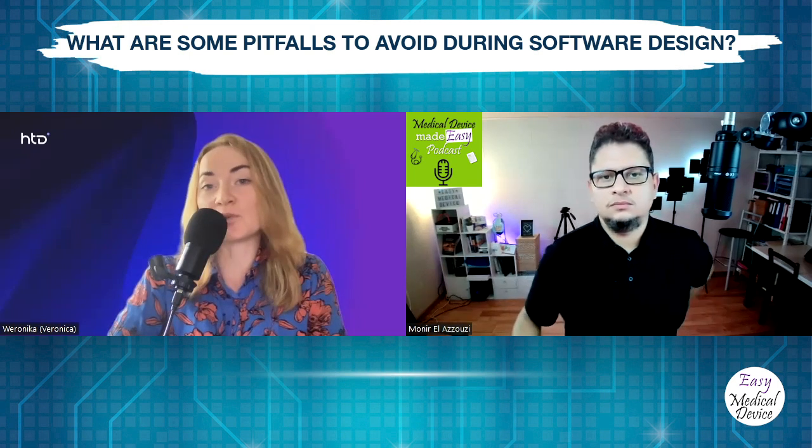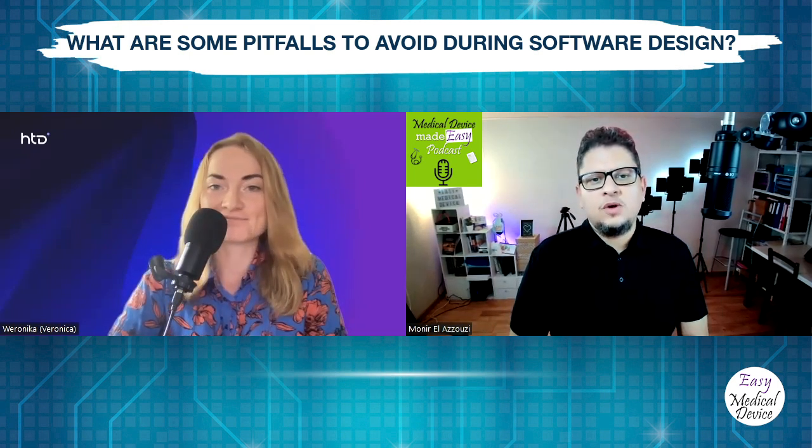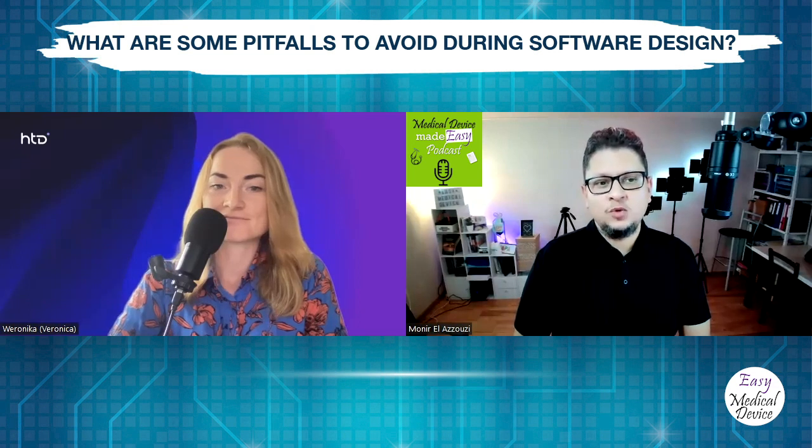If you don't meet all of the requirements, you will not be successful, and you will not even be able to launch the device in the market. So IEC 62366 is the usability standard.